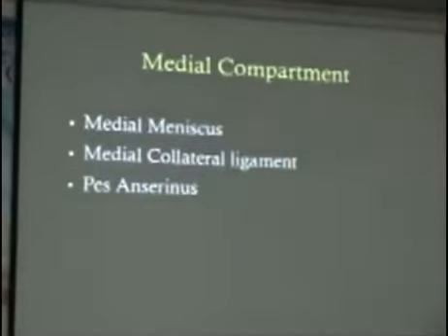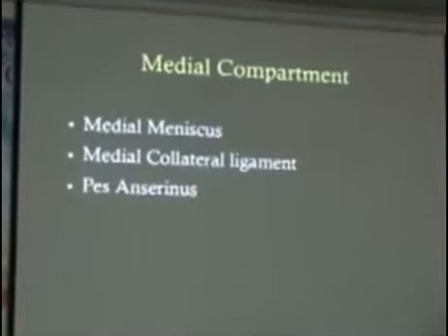So if we move around to the medial compartment of the knee, this is where we look at the medial meniscus, the medial collateral ligament, and also the pes anserine.